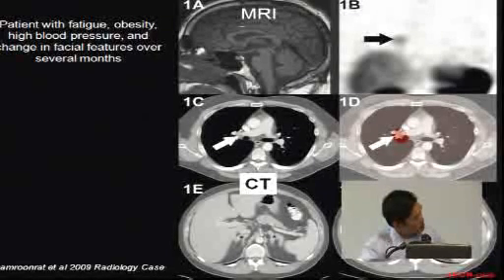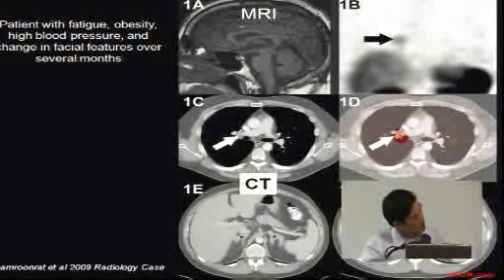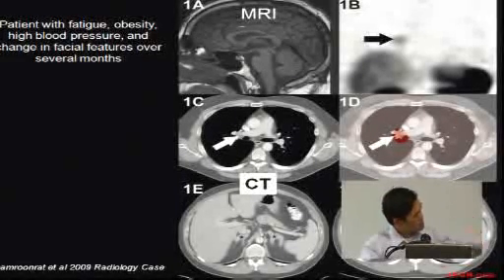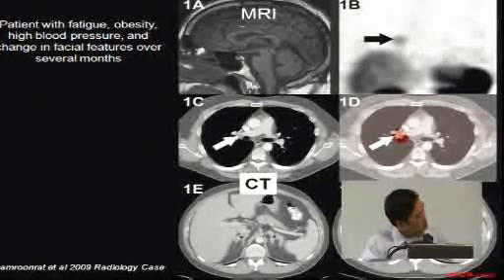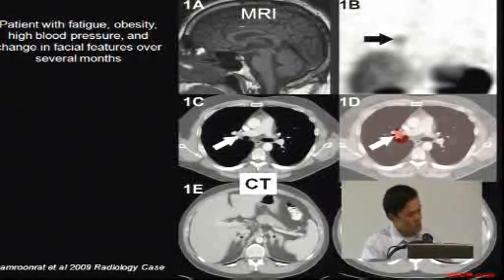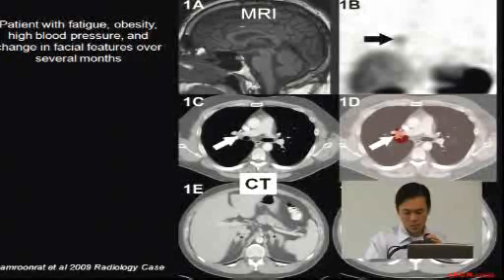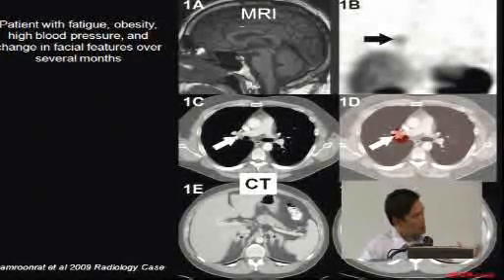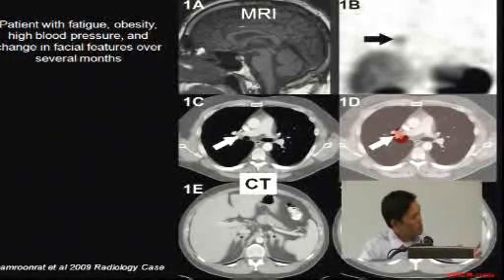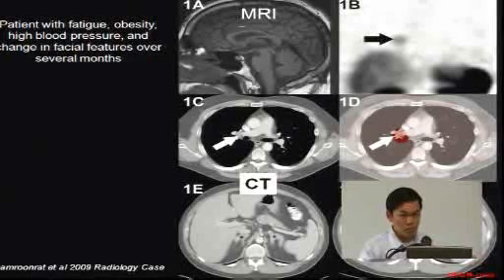And so let me give you a little bit of the topography here. This black space are the lungs. These two little black holes are actually your bronchus. As they're coming down, you have your trachea, and that splits into two, and you have the bronchus. These bright structures are your vessels. The reason why we inject contrast into patients is that we can delineate the vasculature in your body, and that helps us as interpreters differentiate normal vasculature from abnormal tumors.